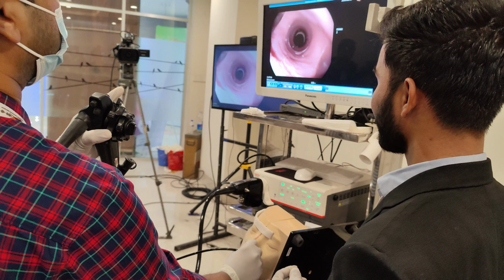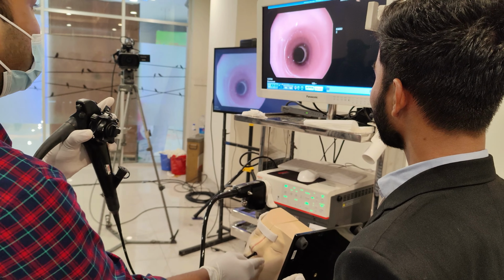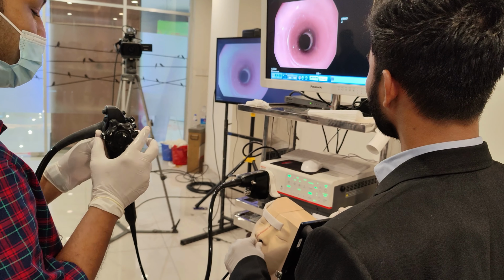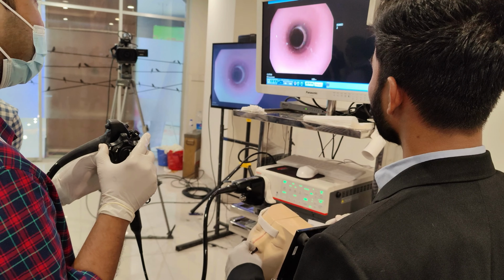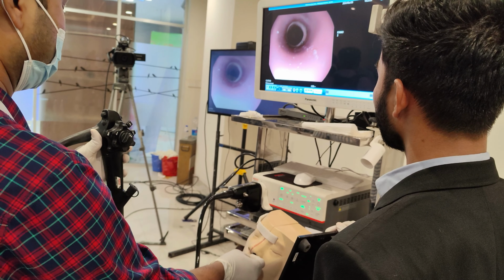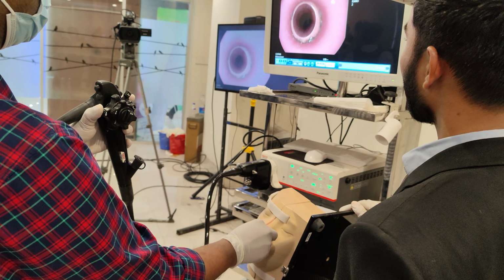Place the tip of the esophagoscope onto the postcricoid region and ask the patient to swallow, then gently advance the scope. Now I am advancing the scope. Do not advance the scope if the lumen of the esophagus is not seen. Visualization of the lumen may require small amounts of insufflated air.